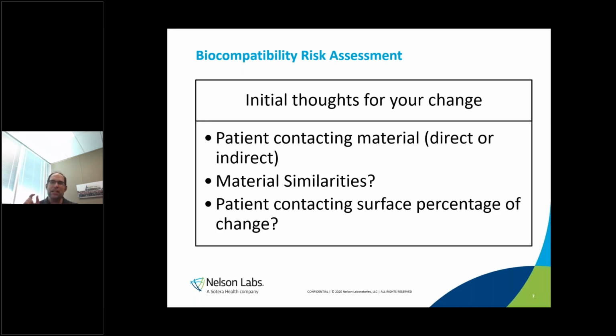A little side thought here, and it has more to do with the initial biocompatibility than it does anything. Biocompatibility is done on surface area to volume ratios. The traditional biocompatibility is, at least.